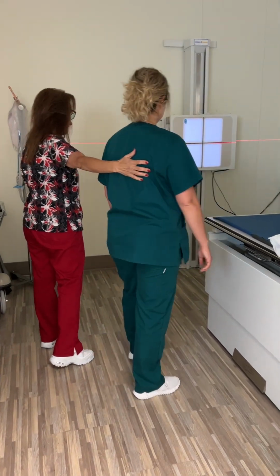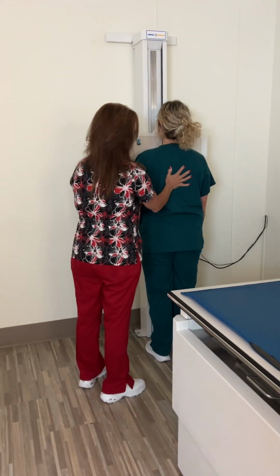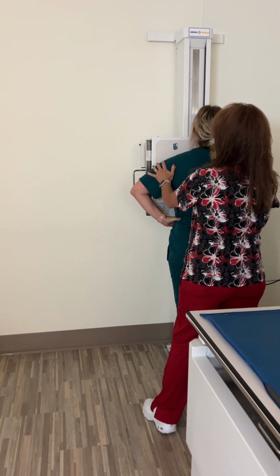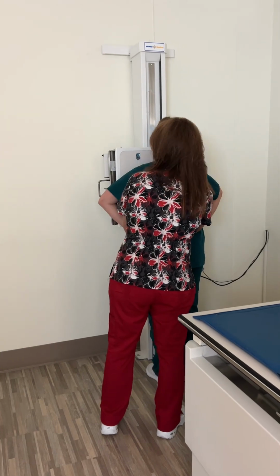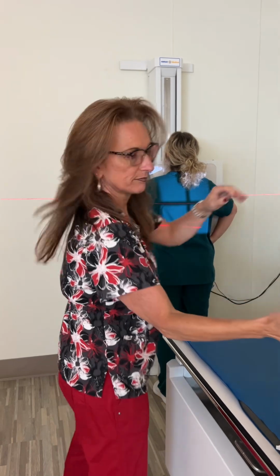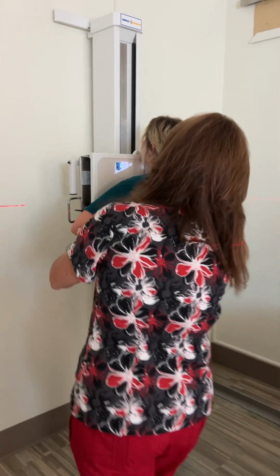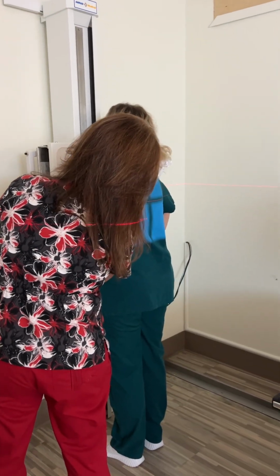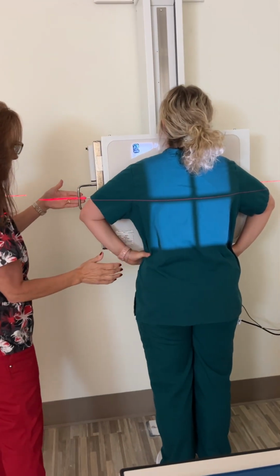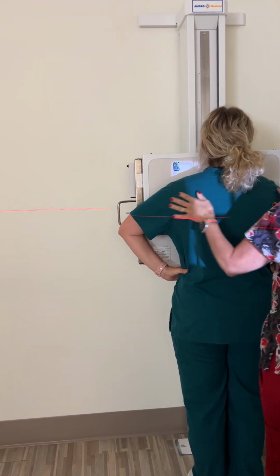So what we're going to do is have you come over here, and we're going to have you face this board for me, right up against it. Good, as close as you can. Kind of hands on your hips for me. Just kind of roll your shoulders forward. Good. I'm going to poke on you a little bit and find some landmarks. So inferior angle of the scapula and midline would put us at T7. So that looks good like that. Markers there. Shoulders rolled. Good.